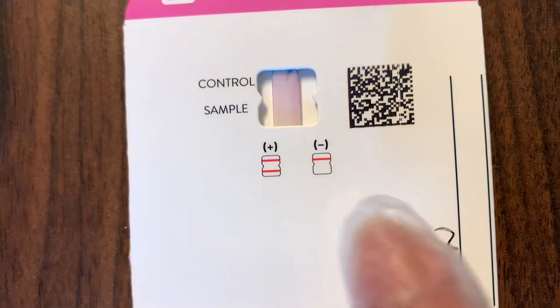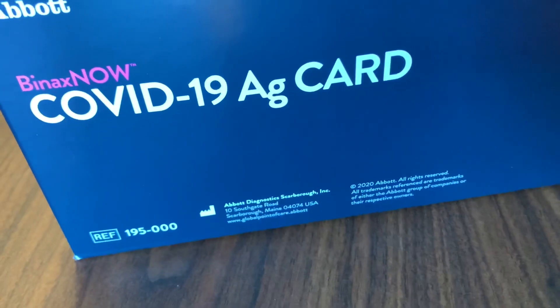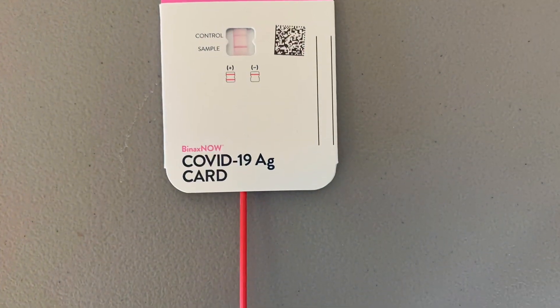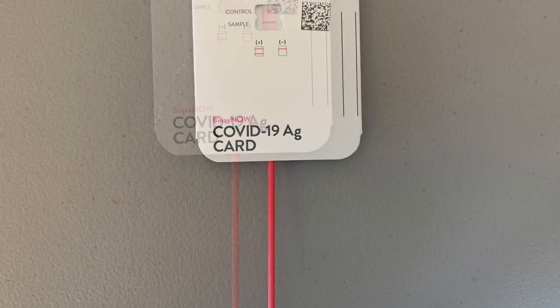And as you can see, two lines means positive and one line means negative. In this demonstration, we used the control which comes with a red handle — and as you can see, two lines: positive.